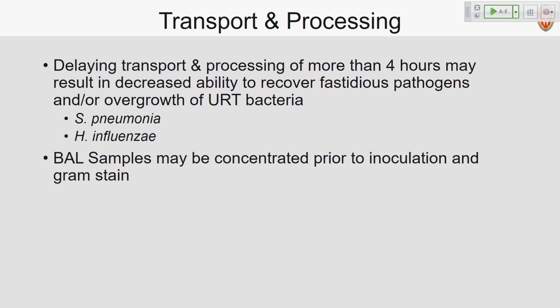Also, with processing BAL samples, you may consider doing concentration prior to inoculation and Gram stain. A lot of what I'm pulling from here is the ASM Clinical Microbiology Procedures Handbook, the most recent edition, and it doesn't take a strong stance one way or the other on some of these items. So it's worth noting that it is open to how you would like to practice at your institution, and to having those conversations and looking at the benefits and limitations of any way you would like to do that.